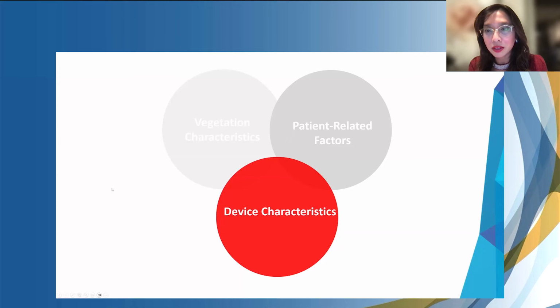I think in terms of access sites as well, whether it's suitable, that's a consideration. With TE, if you want to go the transgastric view, that'll be very helpful. ICE imaging is really good because you're right there, depending on where the location of the vegetation is.